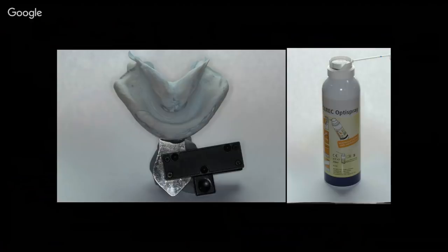Yeah. How many dentures can you print with one bottle of resin? Oh, I wish I knew the answer to that. If you look back at that picture I showed, with me printing those articulation pins and the supports, two bases was going to take 53 milliliters of resin. So if you do the math on that, I'm not smart enough to do this math in my head, but work backwards. Those are 1 liter bottles, and you could kind of do the math on what you could expect for the cost of a denture base.